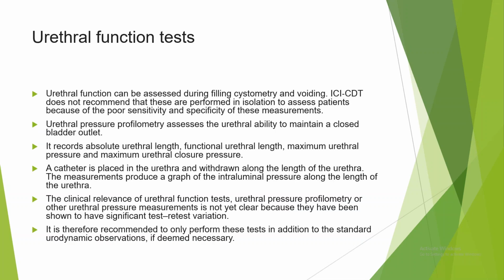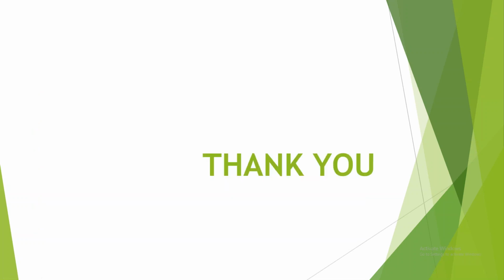Now, urethral function tests. No need to know about all these things because they are not recommended by NICE, as their relevance is still unclear. The only thing they will record is that after doing the cystometry, the catheter is withdrawn slowly from the urethra and it will measure the urethral length and pressure inside the urethra. But it is not recommended, so we need not know this. So girls, this completes the urodynamics.